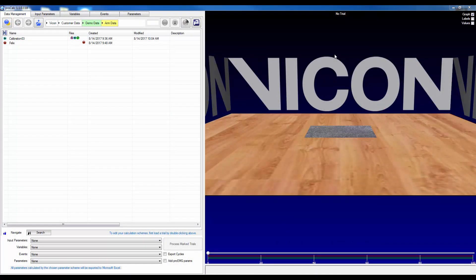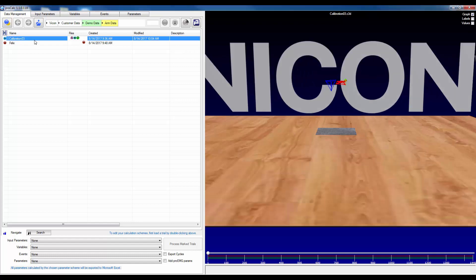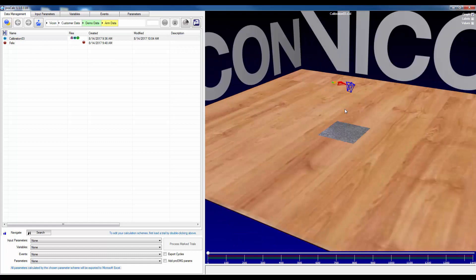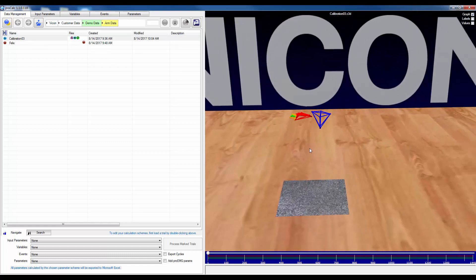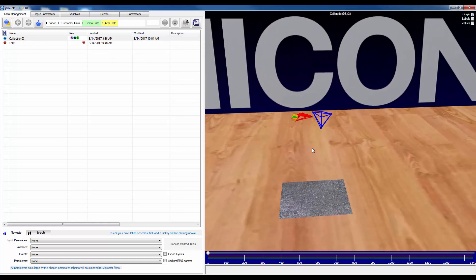When you first open ProCalc, there are five tabs across the top. The first is data management, and this is the same data management that is shared by Nexus and ProCalc. This allows you to select trials, as I will do here — that same range of motion trial — as well as select multiple trials for batch processing.